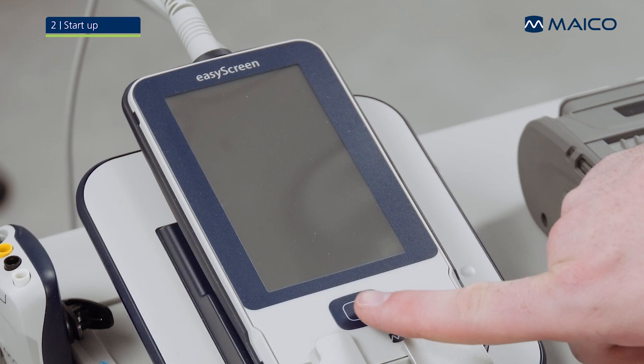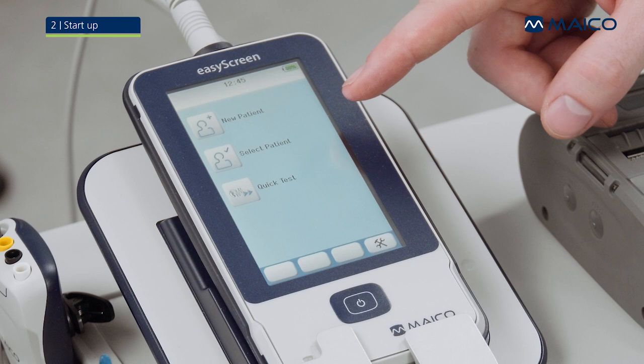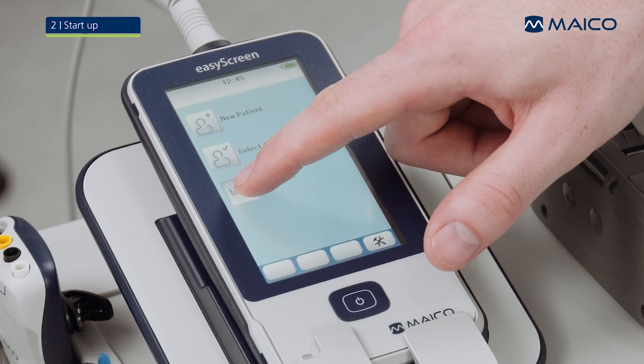Press the home button on the EasyScreen once and wait until the home screen is displayed. Now the EasyScreen is ready to go. You can either create a new patient, choose a patient whose information is already saved on the device, or start a quick test without entering patient information.